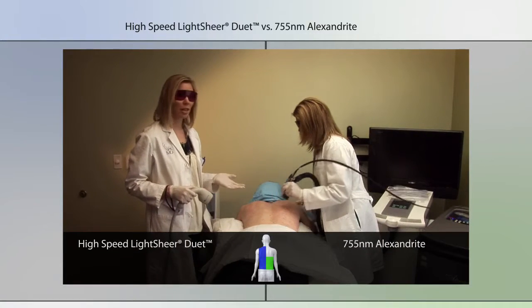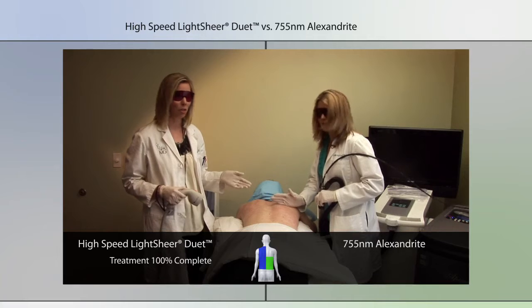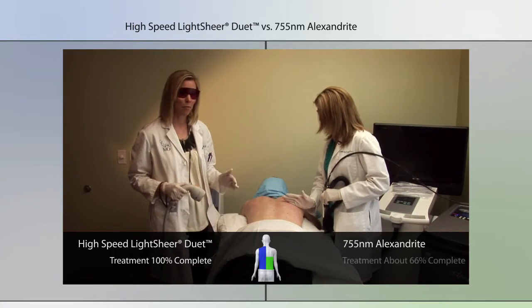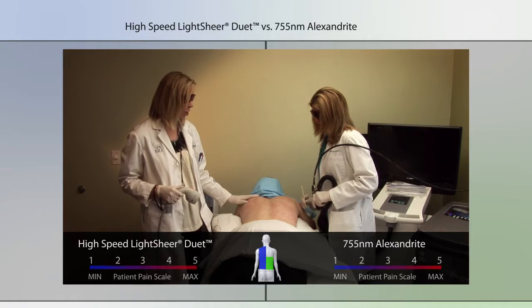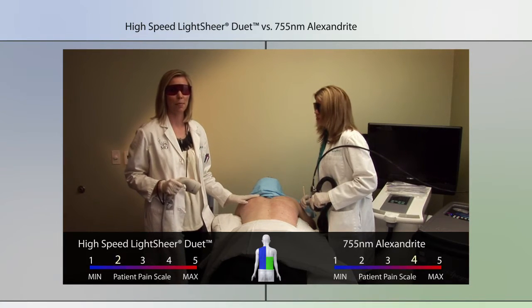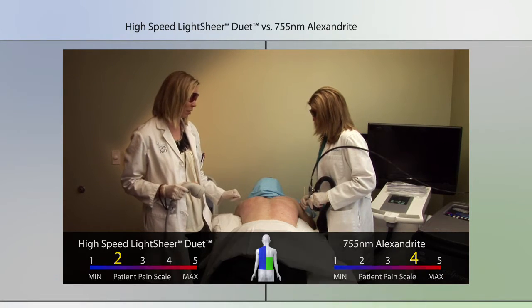At this point, I've been done for about a minute or so. Laysan is still working on the right side, which is the Alexandrite side. She's at this point about 2/3 the way up, and I've been done for a minute or so. As you can notice, there's very little erythema in regards to the patient, and it's been a very comfortable procedure for the patient. Again, he was indicating a pain of 2 out of 5 on a 5-point scale for discomfort.